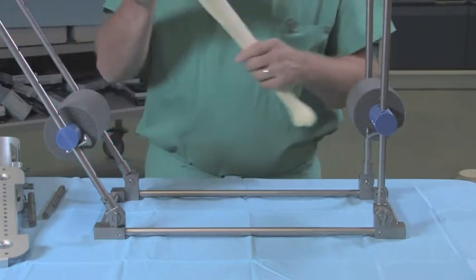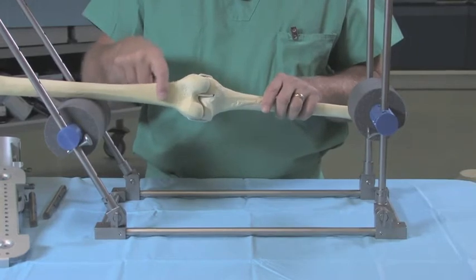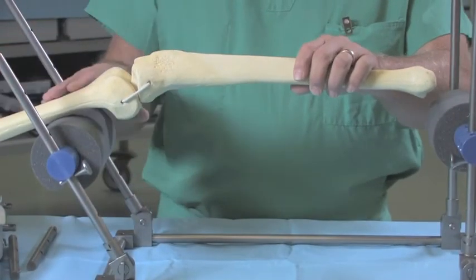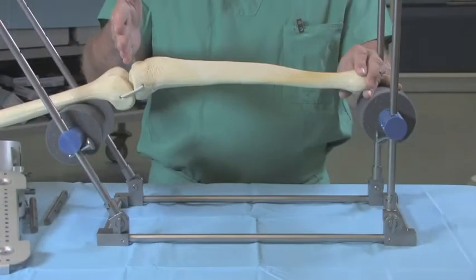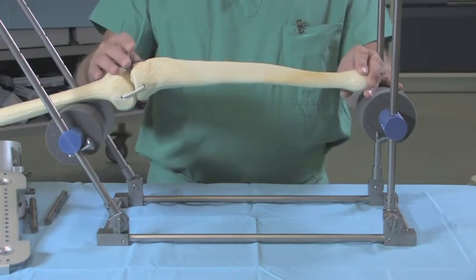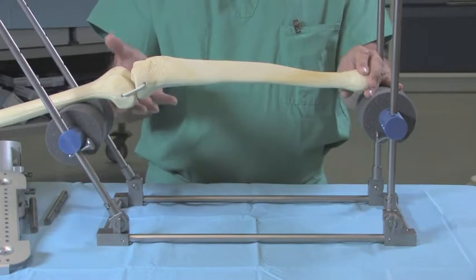Conceptually, the distal femur is actually quite flat, and so this lends itself to have a good interface with the fulcrum. This allows traction to be applied, and you have complete radiographic visualization of the tibia, and also 360-degree access to the tibia and distal femur.